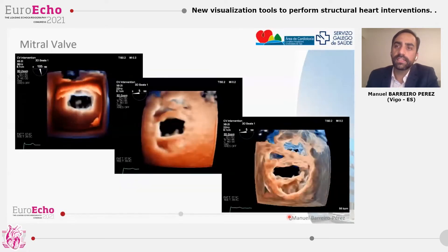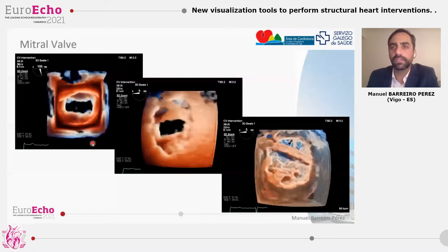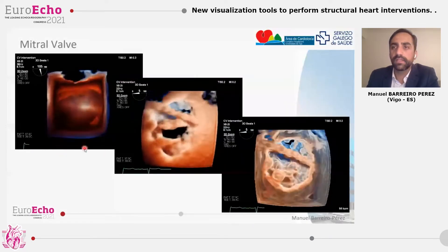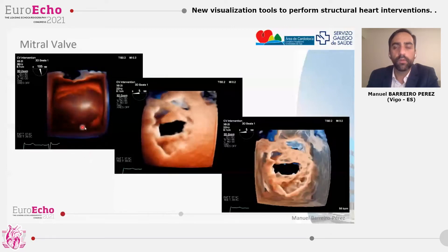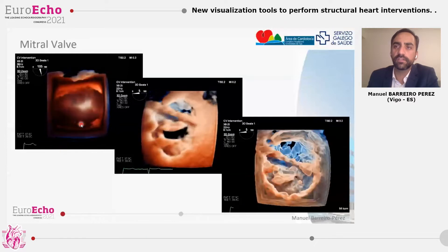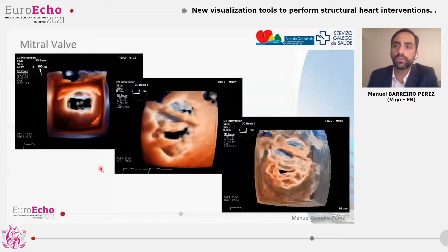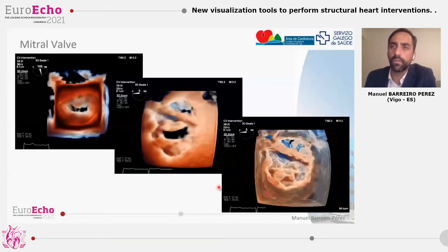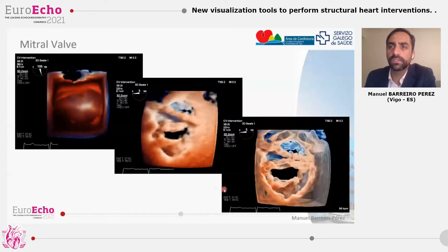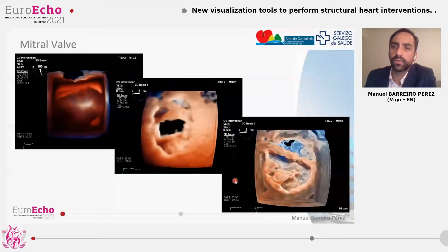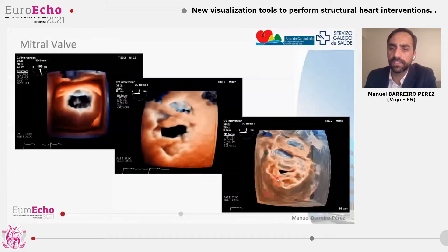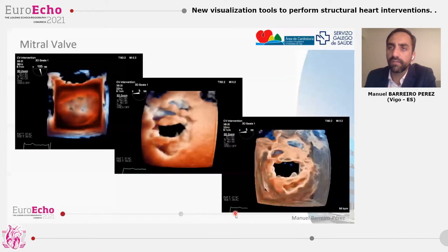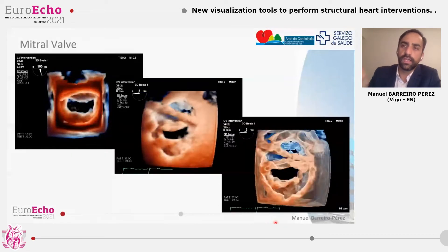If we place the light in other positions, we could study the mitral valve with transillumination, and it's clear how the commissure and the coaptation line appear. This is especially useful when we have problems with the quality of the leaflets on the mitral valve, for example in valvular disease. In these two images from the left ventricular perspective of the mitral valve opening, we could see how the mitral valve apparatus can be studied with these two renders, especially with the glass view that enhances the borders. This is also clear for studying the mitral valve area in cases of mitral valve stenosis.